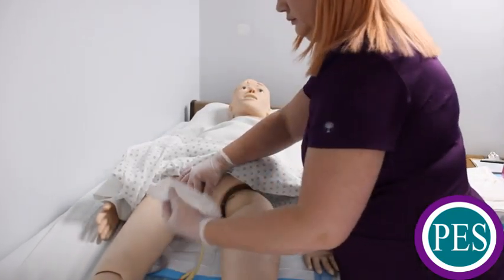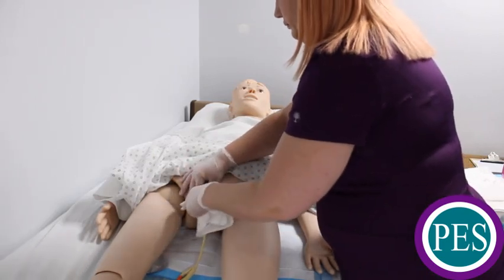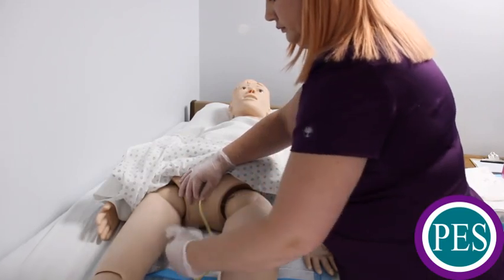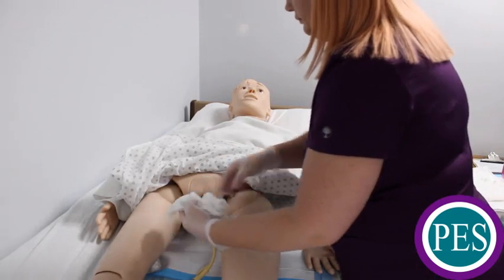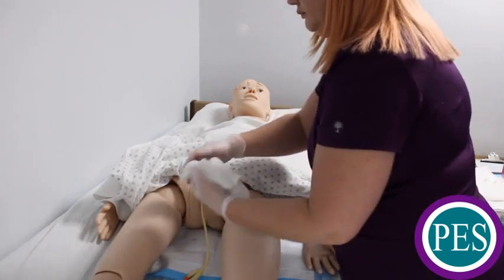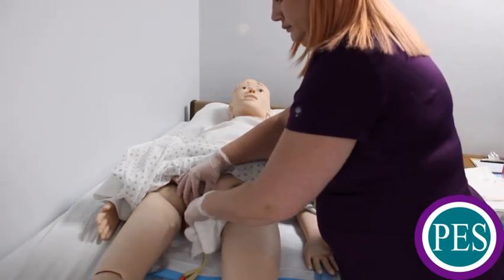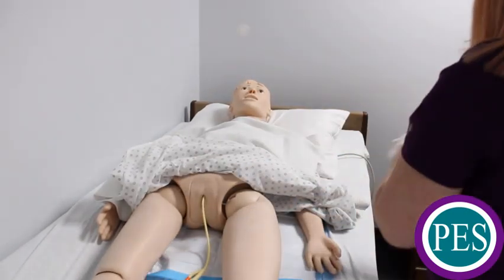Next, while holding the catheter still, rinse at least 4 inches down the drainage tube. Rinse using strokes only away from the urethra, and rinse using a clean portion of the washcloth for each stroke. When you're done, pat dry. Do not allow the tube to be tugged or pulled at any time during the procedure.